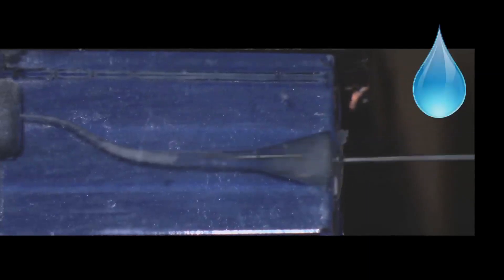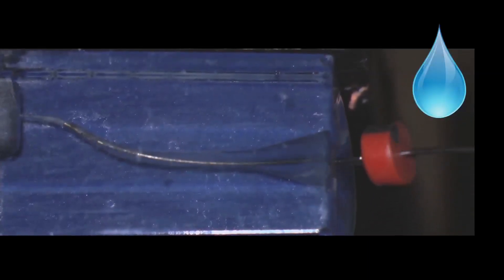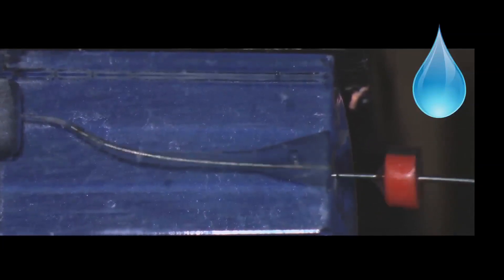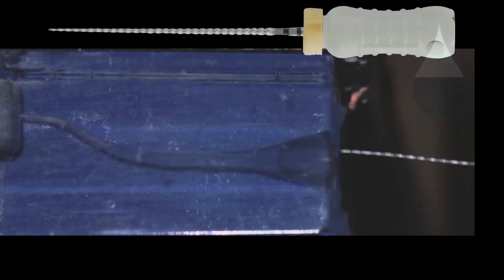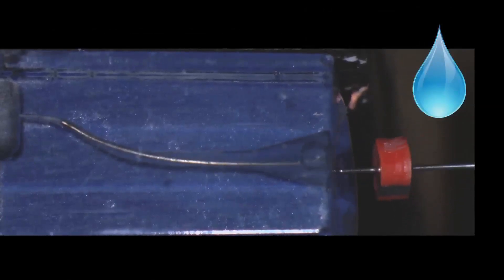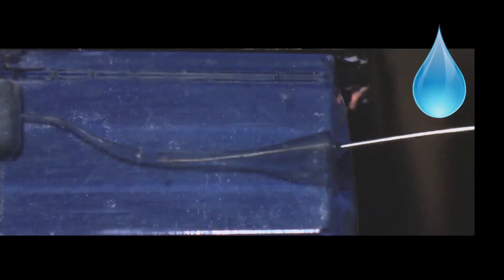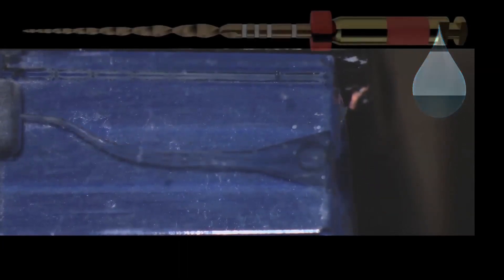We observe the instrument that has the debris and clean the instrument. We go back now even deeper with our irrigation needle and irrigate. We ascertain that the canal is still patent with the file that established working length. You can see the deeper penetration of our chemicals during root canal therapy with the side-vented irrigation needle.